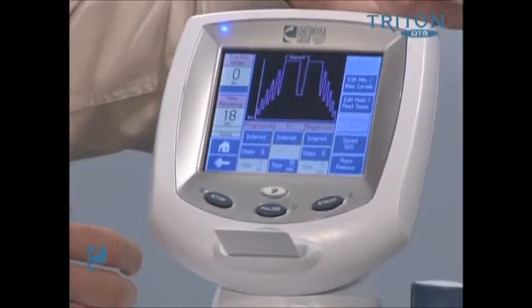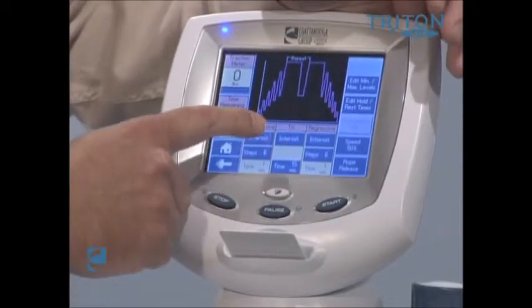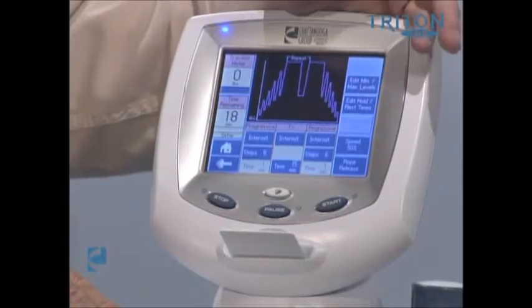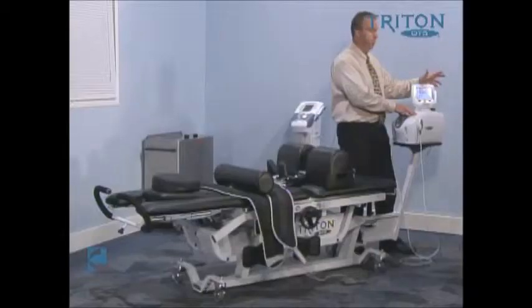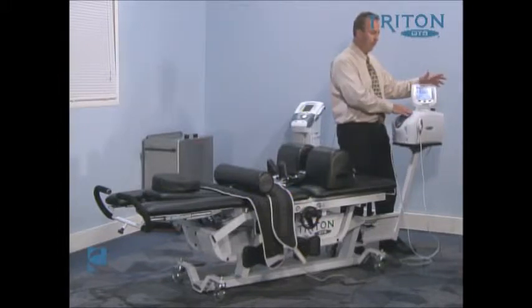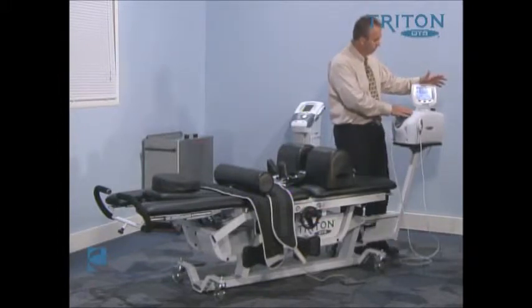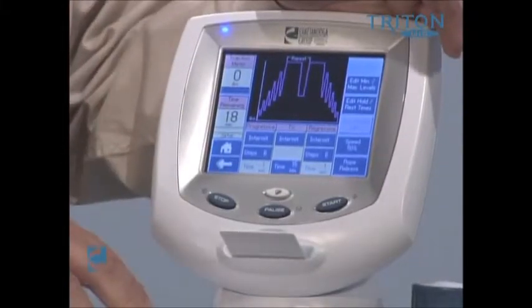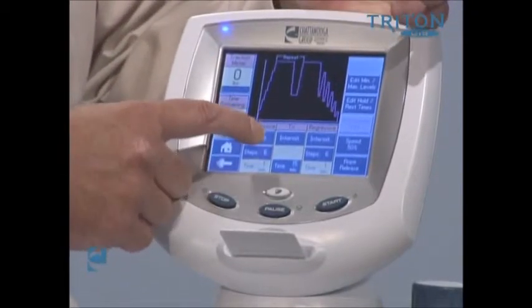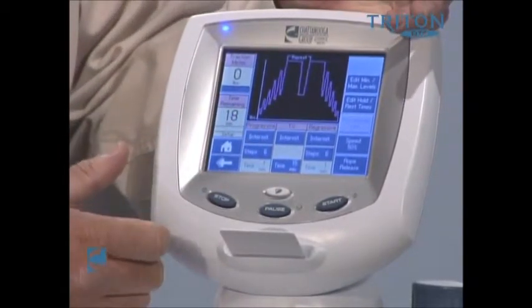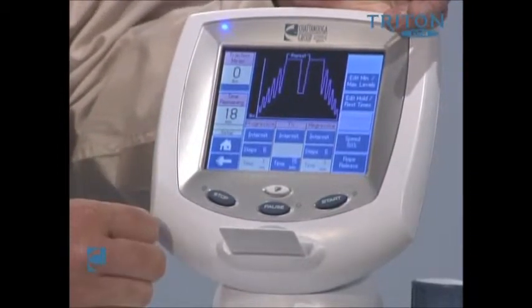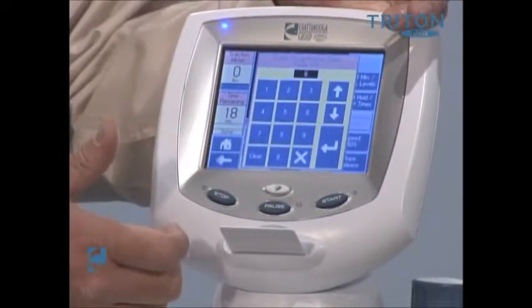Essentially, anything that's in dark blue we have the opportunity to manipulate. We can change the stepwise fashion, so as we're increasing or preparing for the actual treatment protocols, we refer to that as progression. When we finish a treatment protocol and come back down to normal resting position, we call that regression. We have the opportunity to manipulate the progression and the regression from intermittent versus static.